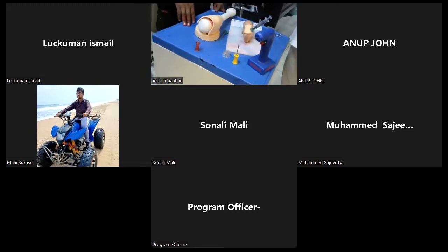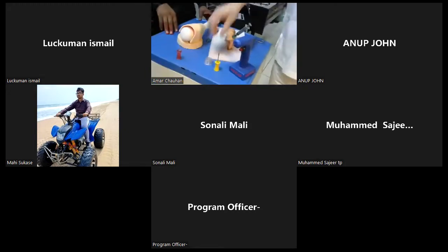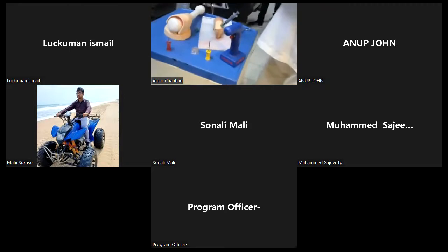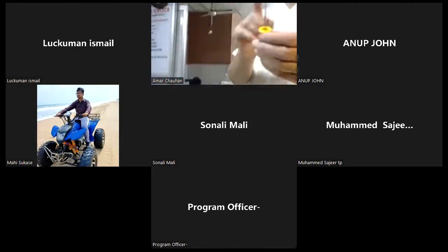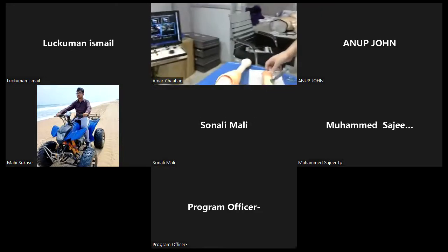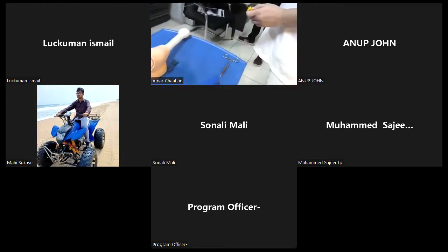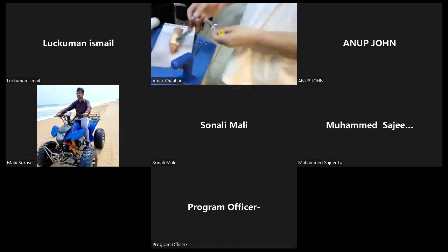Actually, initially we have just shared it. I think it is shared with you. We have written IO, this needle fixer and the connector also. Okay, now got it. We can go to the next. So this is the yellow needle and it is used for doing only humerus IO access. Okay, that is fine. This is the needle connector.